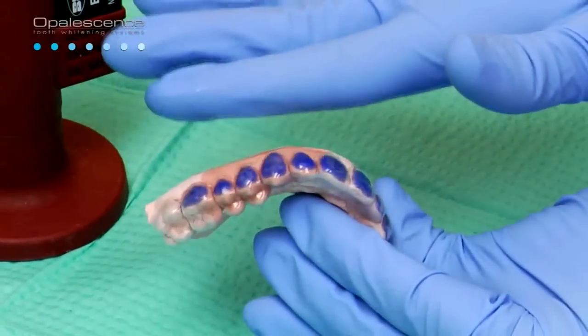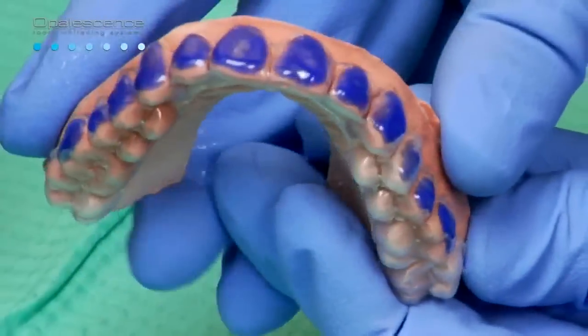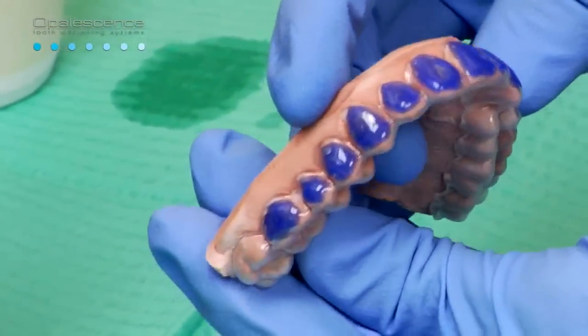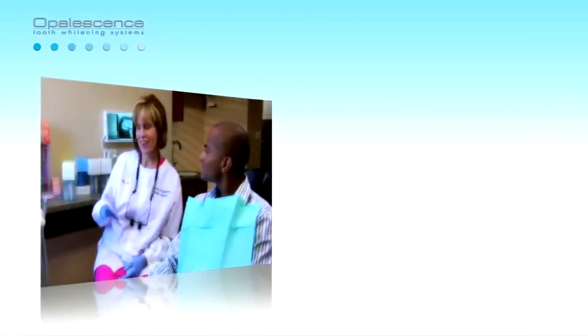While still warm, hold the periphery of each segment firmly against the model for 3 seconds with a water-moistened finger. If an area is short of the desired length, gently heat and push the tray material to the desired location. If this over-thins the tray material, a new tray should be fabricated.